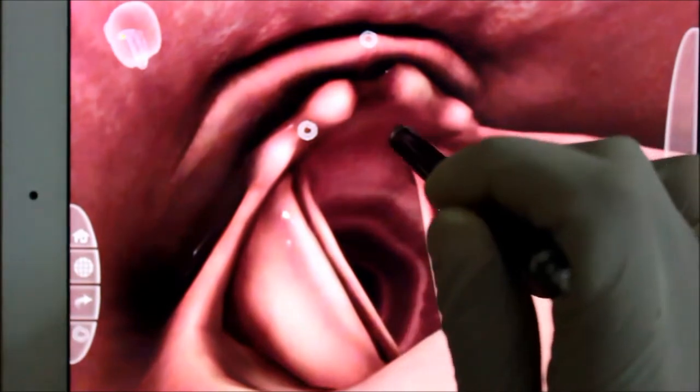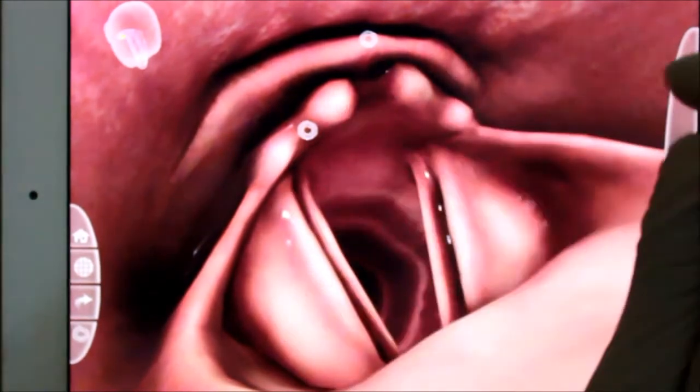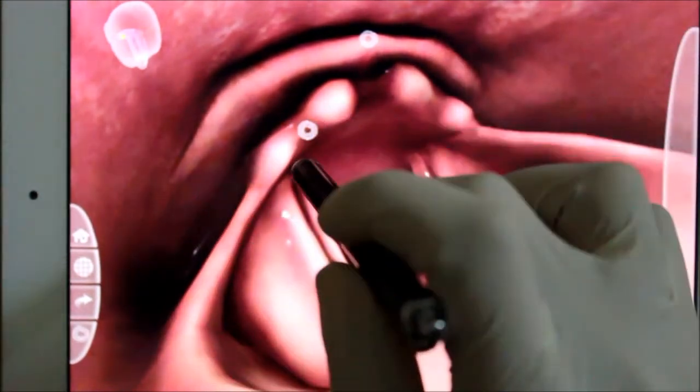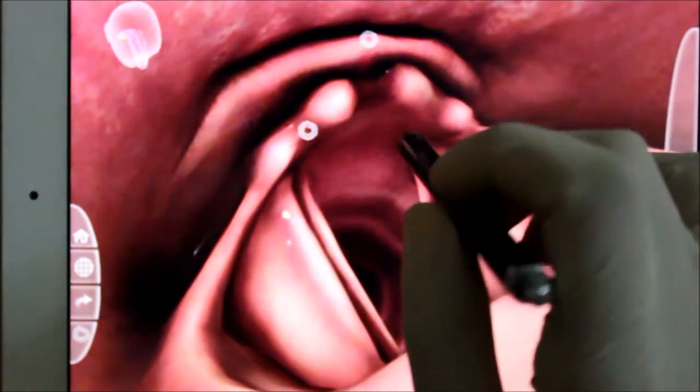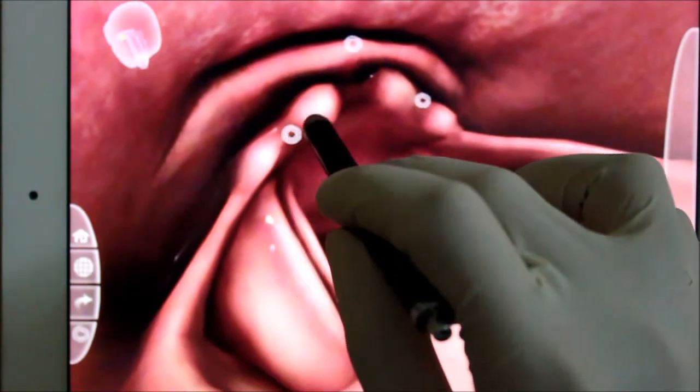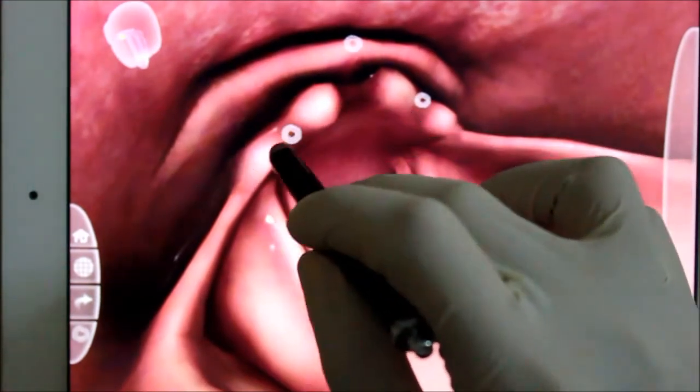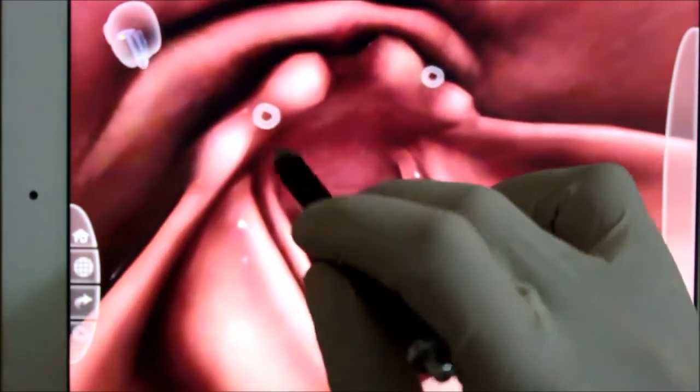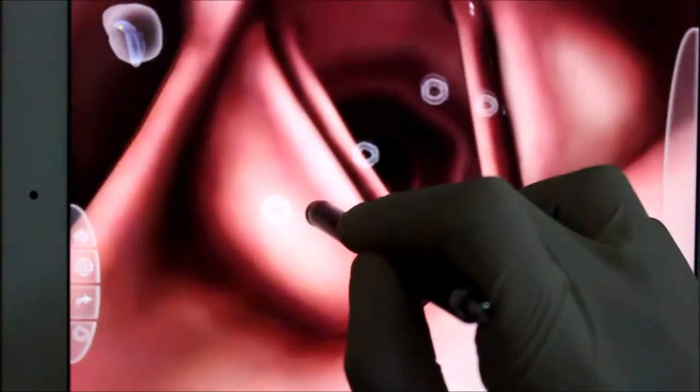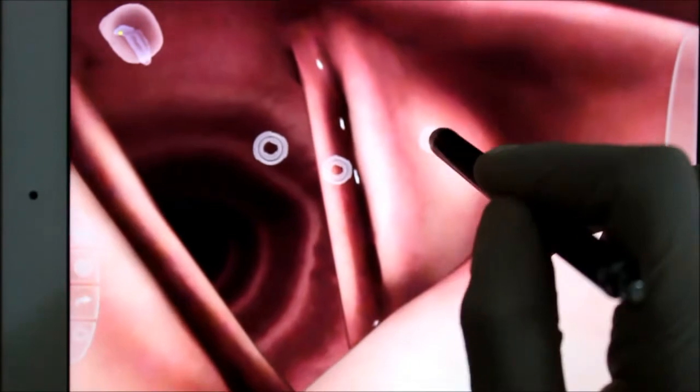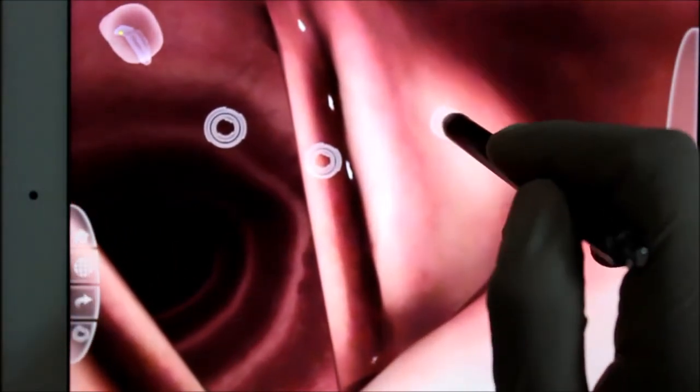our larynx to name: we have thyroid cartilage, cricoid cartilage, cuneiform cartilage, arytenoid cartilage, and many more. Here you can see the fold of mucous membrane over them. They form the part of attachment of the vocal cords also and give the structural integrity. As we go down below we can see the false vocal cord.